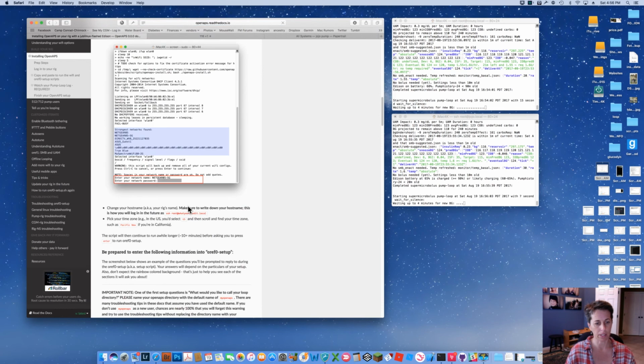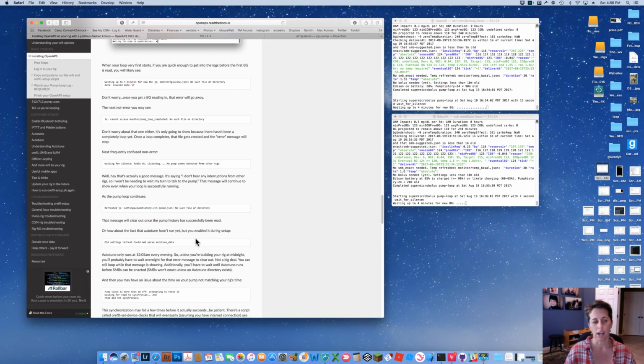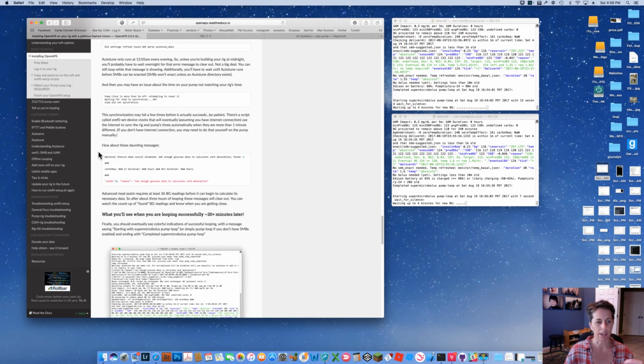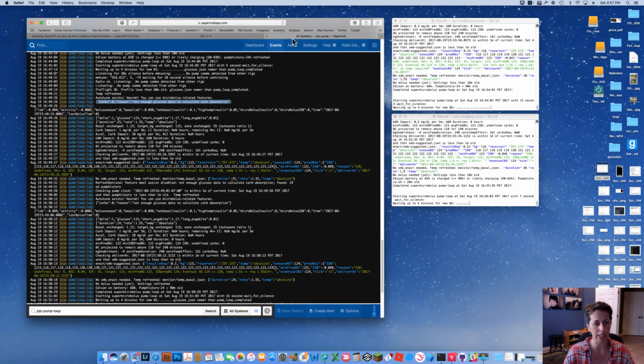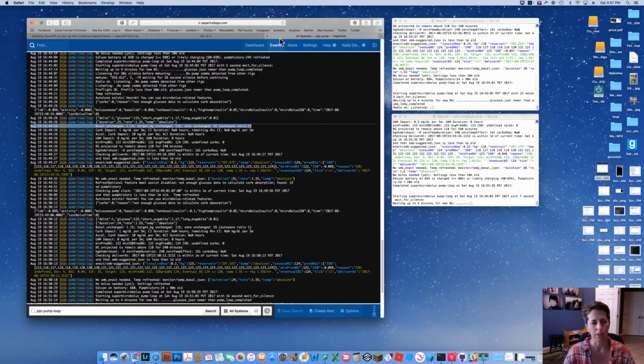So for example, you copy it in, you go down here, and one of the things it tells you is it goes through things that are errors and things that aren't errors. So this one is in there. For example, these messages, it says, nope, you need at least 36 blood glucose readings before the whole loop clears up and goes. So it actually can take 3 hours or so to get that particular message cleared out. But it doesn't mean it's not looping. It is looping. It is setting things. We can see that on the site. It's all enacting. It's setting temp basals. So all of that is great.